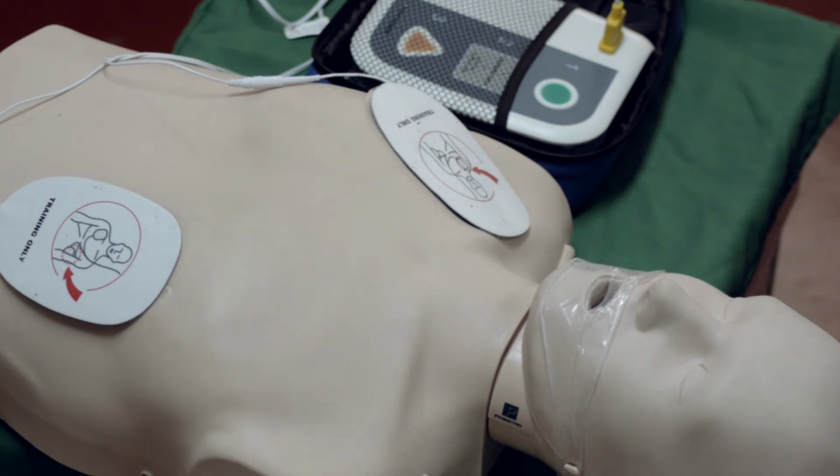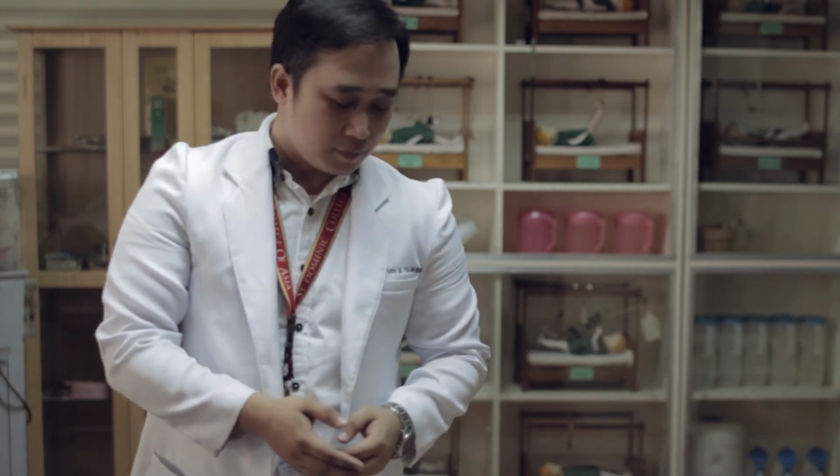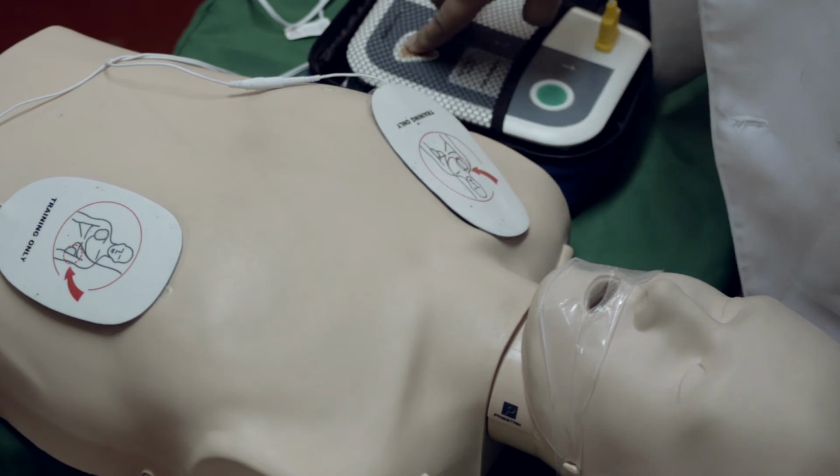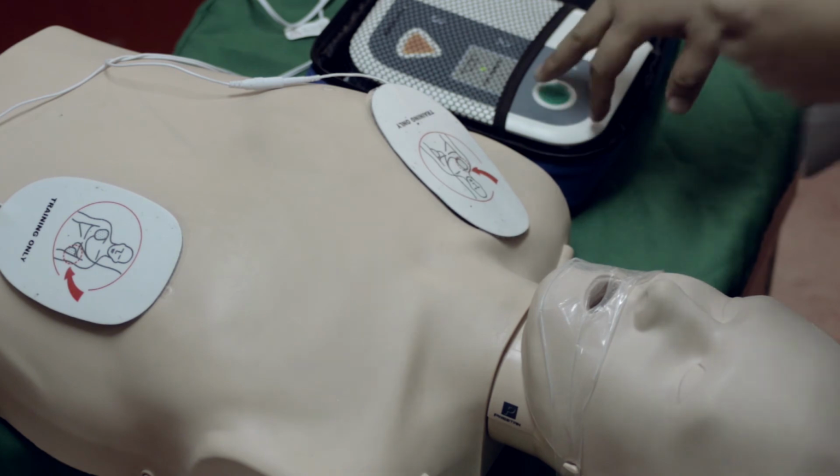Charging. Stay clear of patient. Deliver shock now. Press the orange button now. And it says deliver shock now or press the orange button now. It means that you need to deliver shock to the patient now. So you may say, shocking in 3, 1, 2, 3, clear. Shock delivered. Begin CPR. Okay, that is the initial way of making use of the AED in patients.